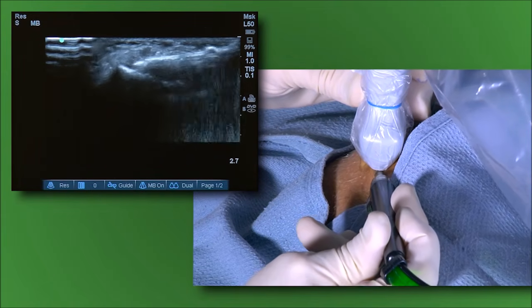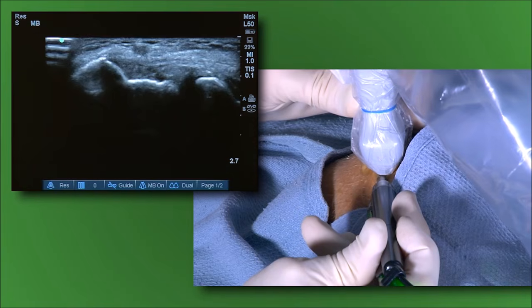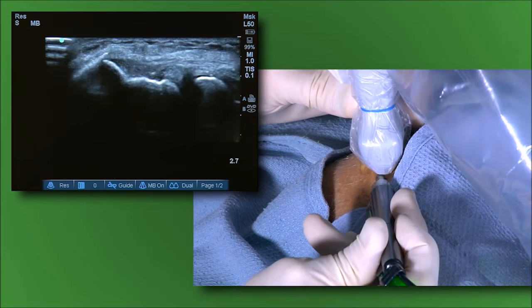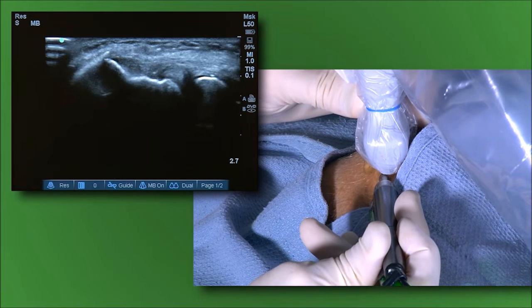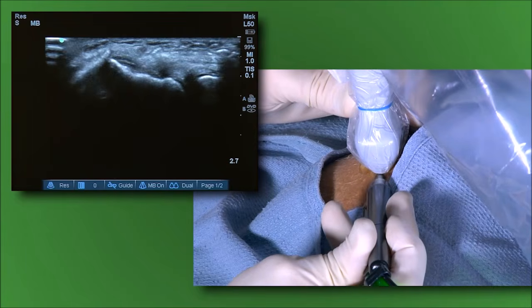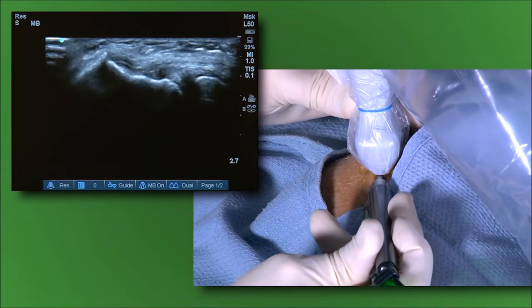You might be able to make out the artifact that is seen in the ultrasound when the energy is being imparted. This is a nice visual so that you know that you are treating that particular area that you can visualize with the ultrasound guidance. So there we can see again the enthesophyte and see the probe right at the base, which is precisely the manner in which this particular problem should be treated.